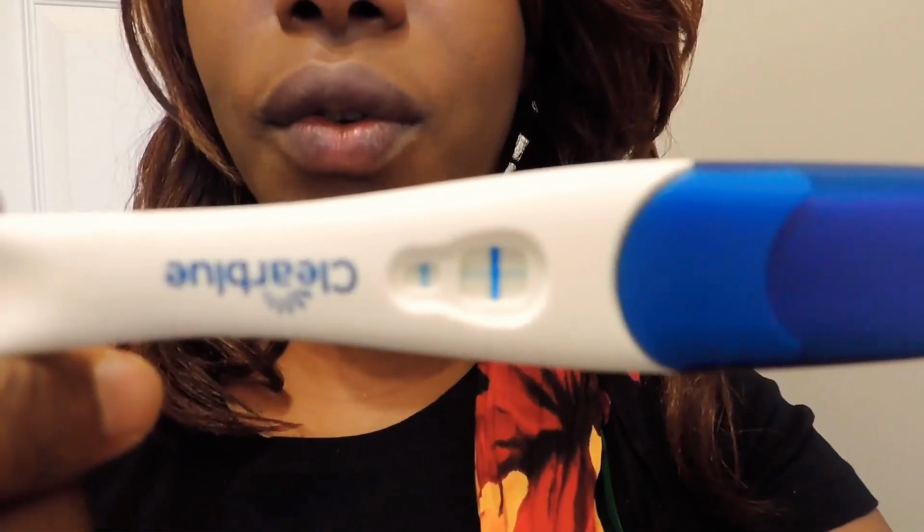Doctors usually want me to come in early, but I can't even get that test. So I guess the comfort for me is being able to test and get a couple of progression lines to let me see that things are going really well. So that's good news for that test. But the progression line in these ones is amazing. So dark.